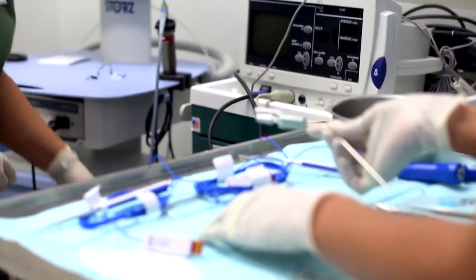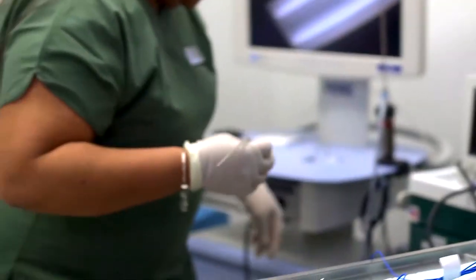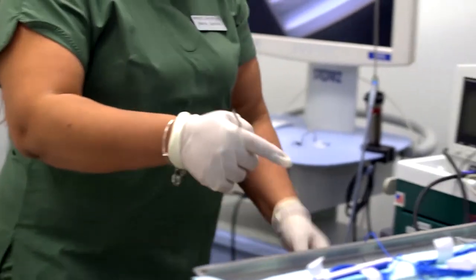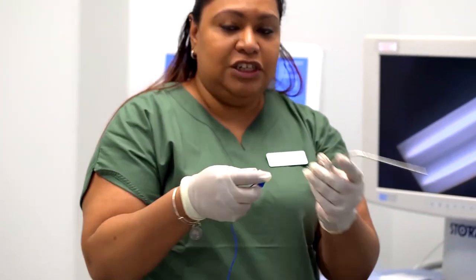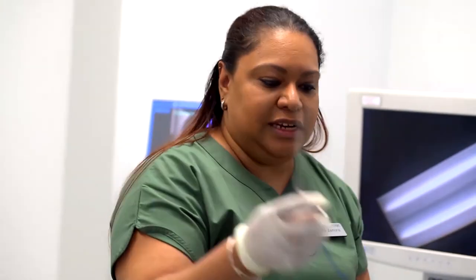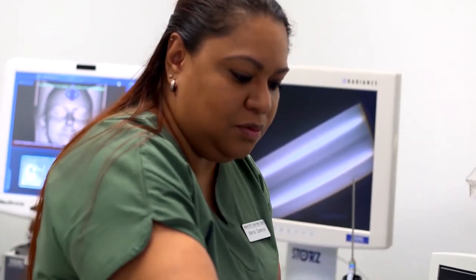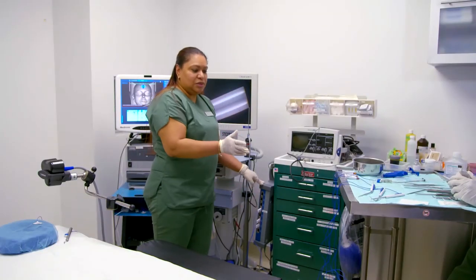The next thing that we do is put in the suction cup. The suction also, you have to make sure that the two little things align and that you hear a click. And this could stay on the table because it's going to be connected to the suction catheter once we're done. This is our Axiom box where we connect all our balloons and our instruments.